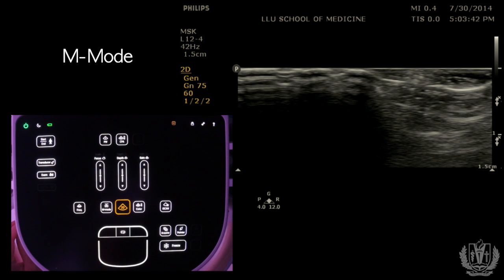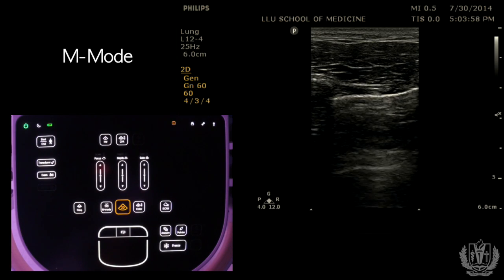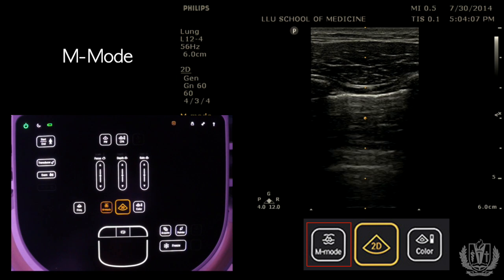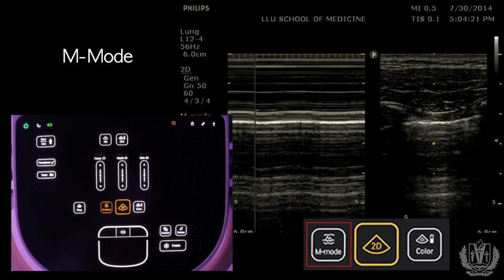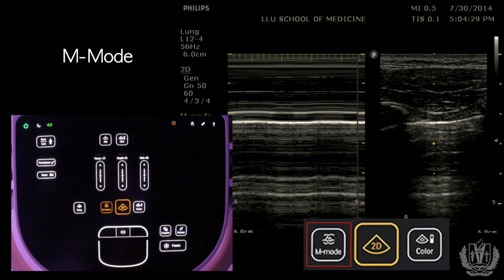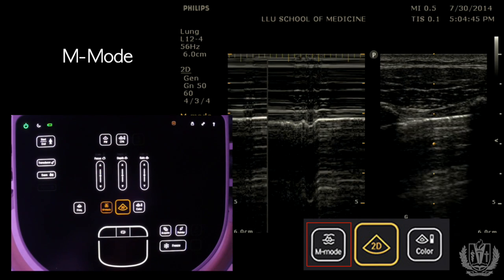Another important mode is M-mode, or motion mode. Switching to the lung setting, we're looking at lung sliding — the visceral and parietal pleura sliding across each other. When you place the M-mode cursor, you see yellow dots going straight down along a single line. The ultrasound probe measures motion along only that one line over time. When you activate M-mode, everything else disappears and it scans that line across time, capturing the motion of your structure. This is normal lung sliding, showing a sandy appearance as the patient breathes in and out.